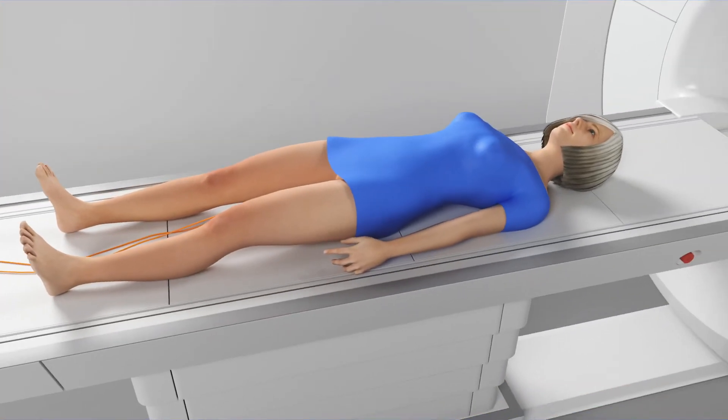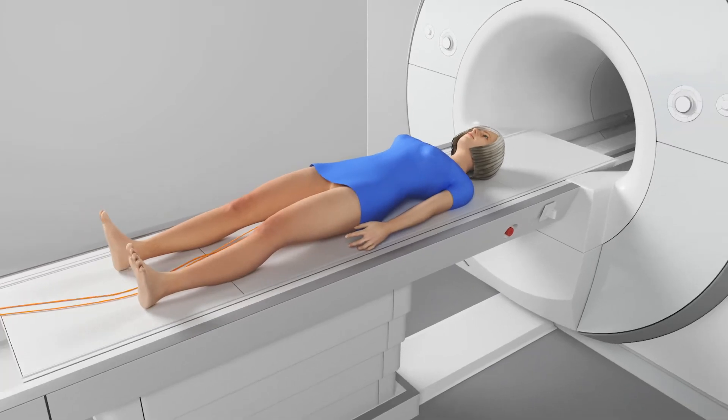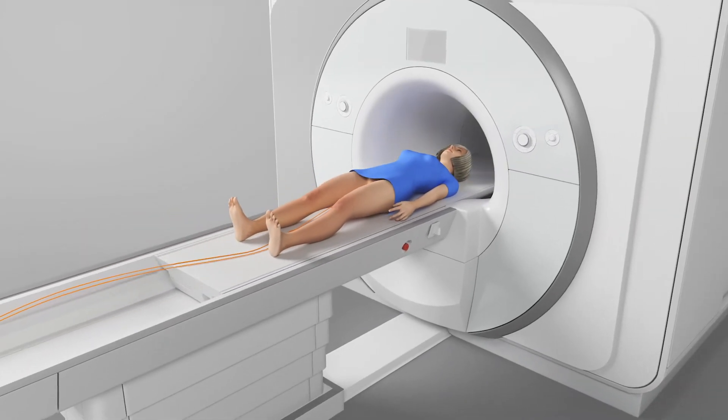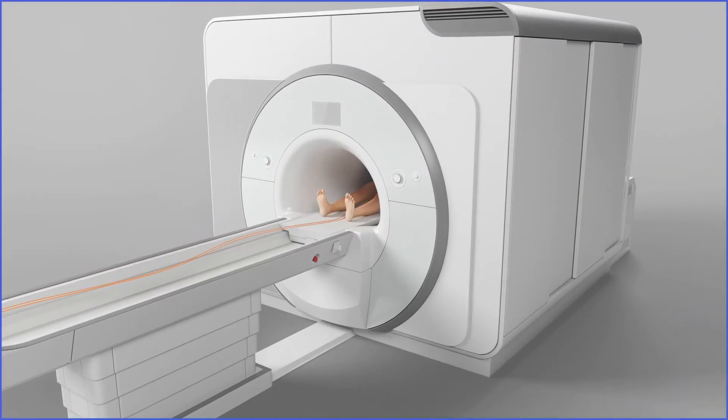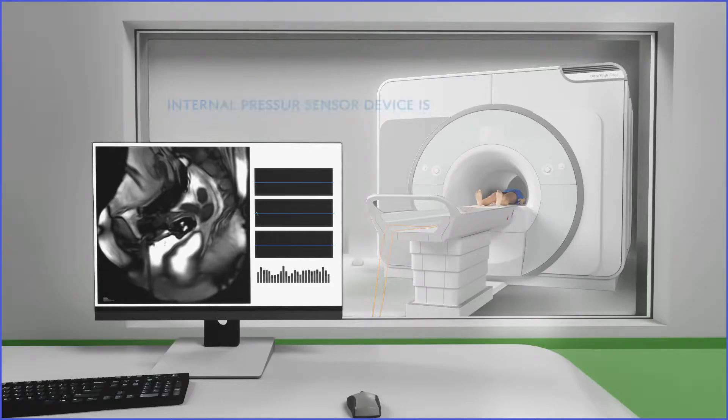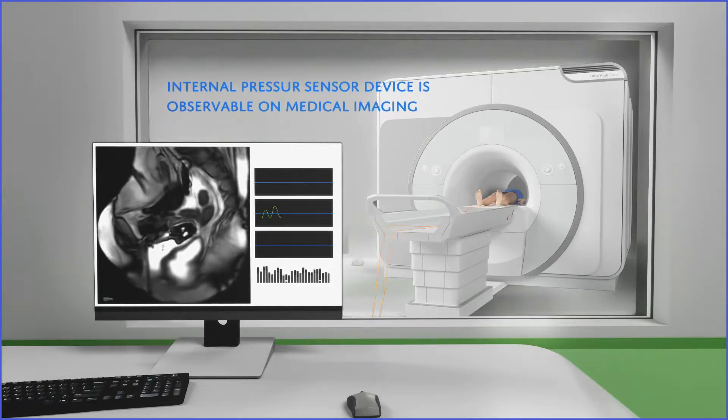Then, the medical image exam can be proceeded. The pressure medical device developed is not disturbing the image acquisition and medical exam. The pressure sensor is observable with medical imaging equipment.